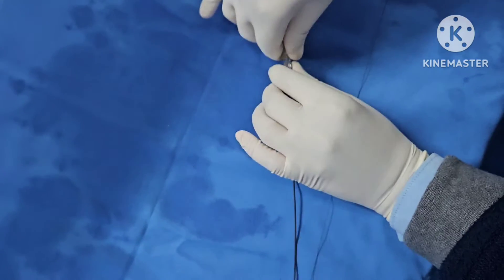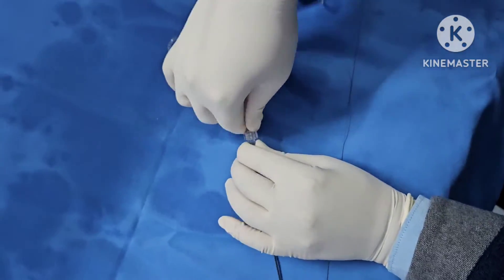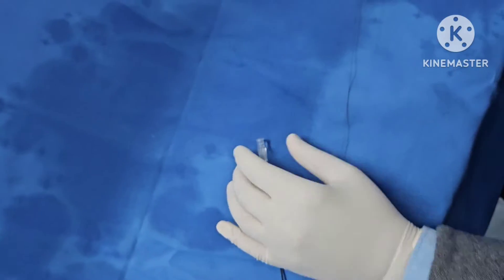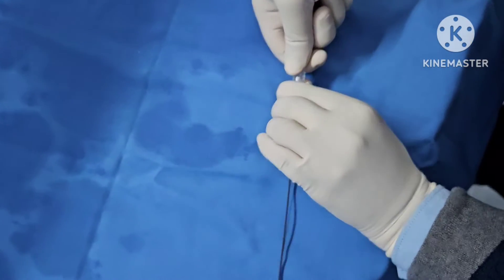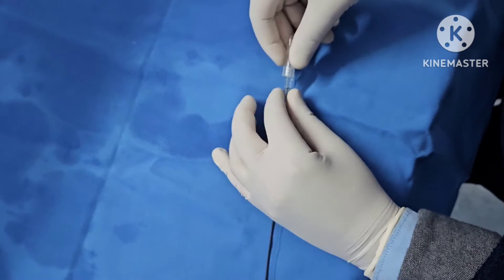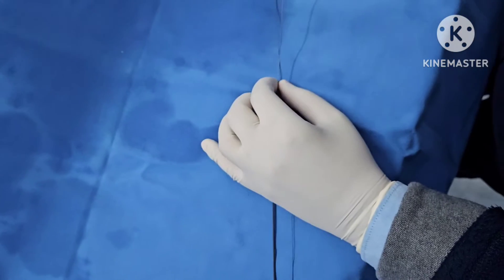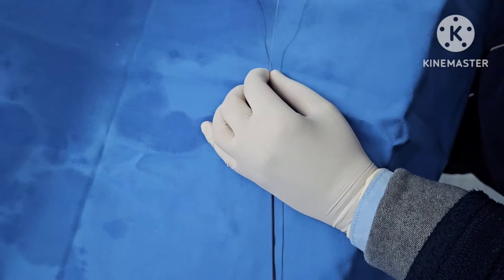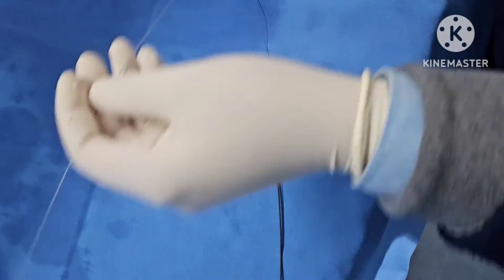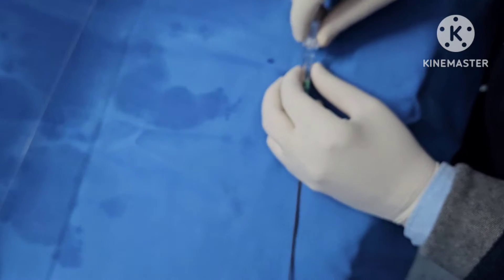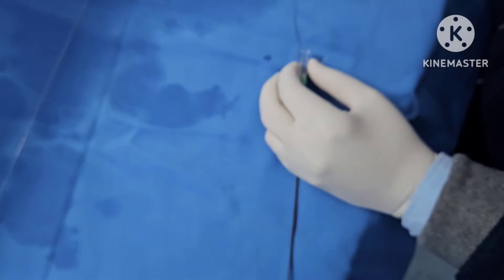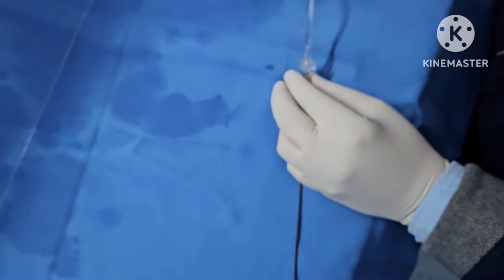So next, please come here. What we are going to do, show here, we are going to remove this stopcock. Can I show you? Yes. So we're going to remove this stopcock. Next, what we're going to do is that we will be removing the stilet. Yes. So this is the stilet. And we're going to remove the stilet. And this is done. Remove the stilet.